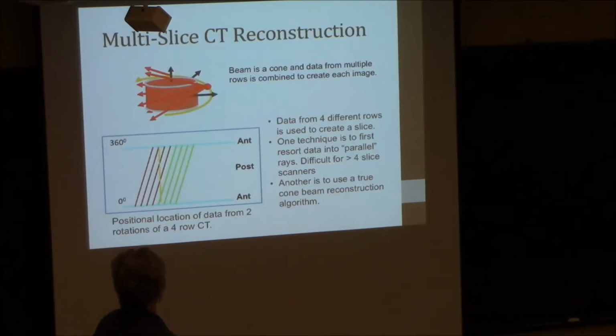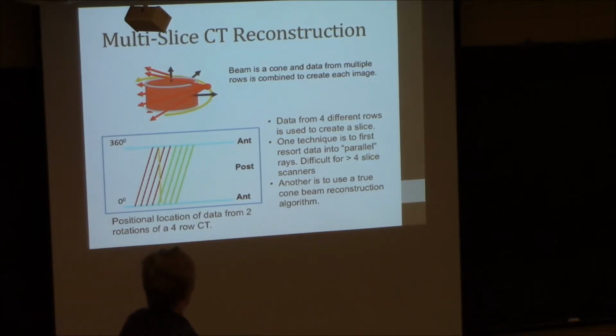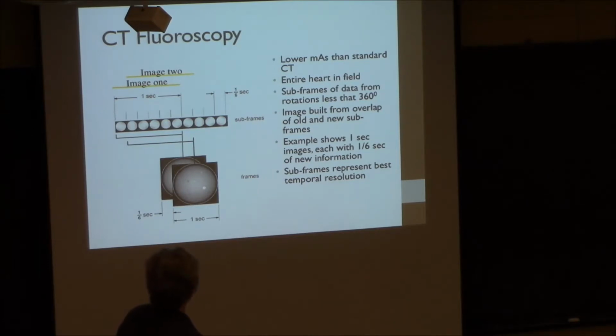Of course, it did some things to the reconstruction problem, because now instead of having an image taken straight through and another one taken parallel to it and another one taken parallel, so you could reconstruct these nice parallel slices, you have data acquired at all different angles, and you have to go back afterwards and say, I'm going to take something from that detector and something from that one and that one and that one, because we still create these single slices that are parallel to one another. So it raised a whole lot of work being done on reconstruction algorithms for how to get around the artifacts that are caused by that sort of imaging technology.